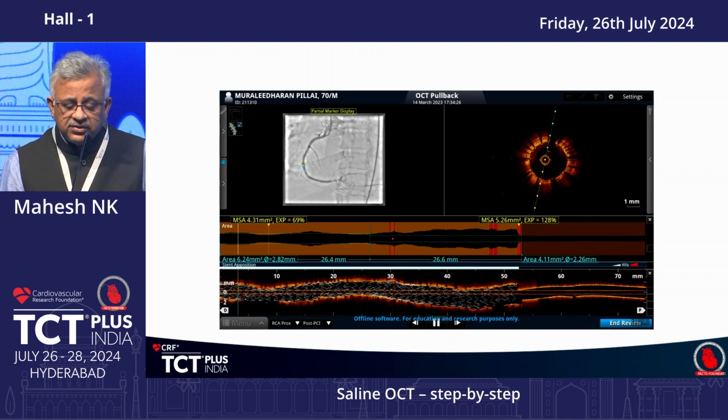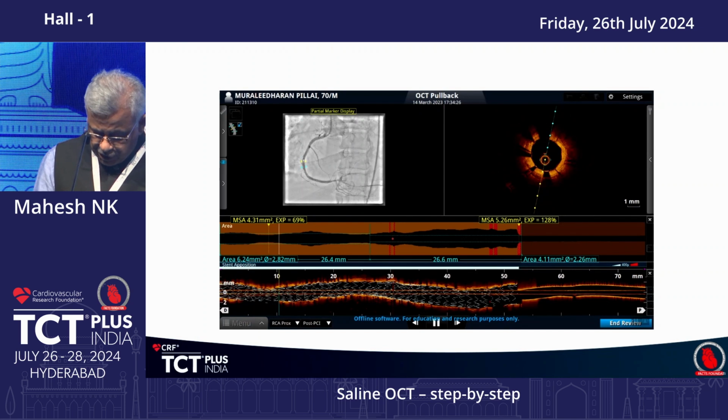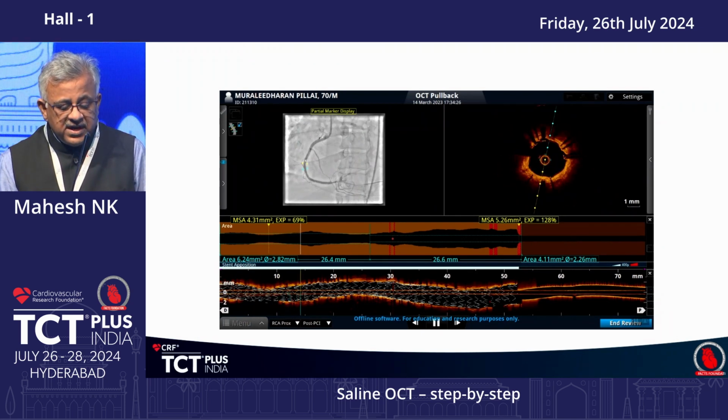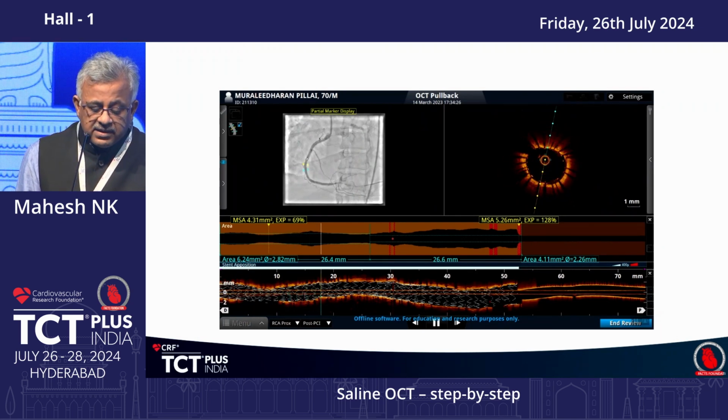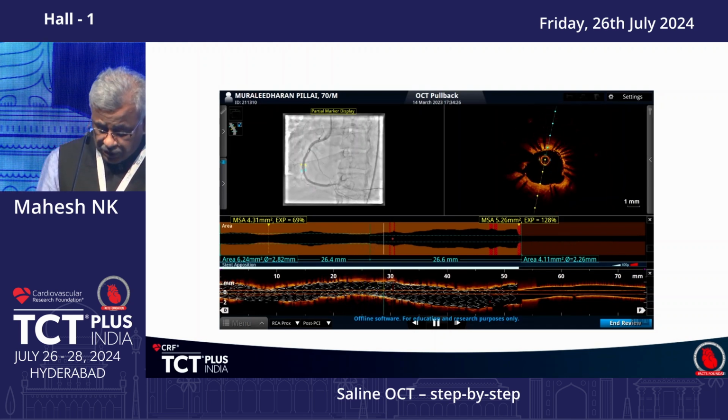Again, you use about 3 to 4 ml of contrast only for these combination shots. This is the final shot that I usually do, so that I can get the co-registration, I can get the distal vessels, I can rule out any perforation and or slow flow.